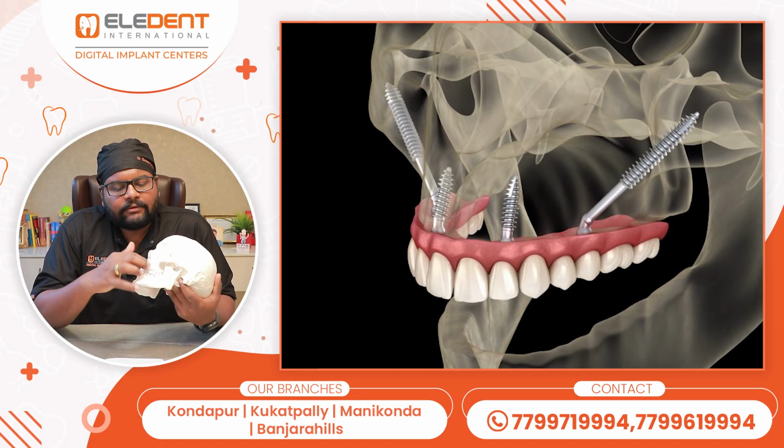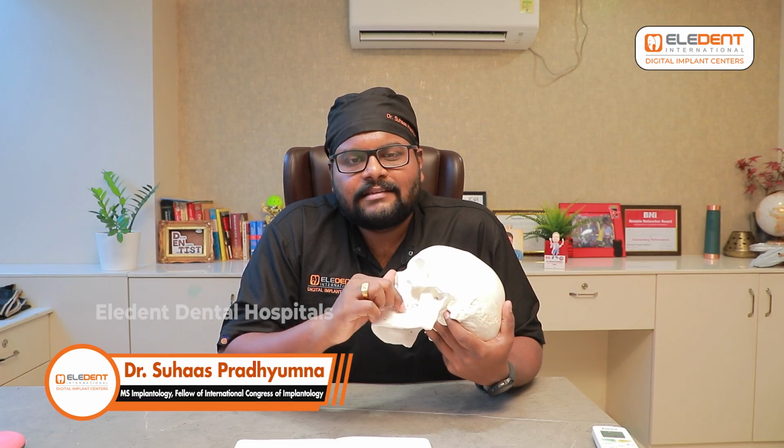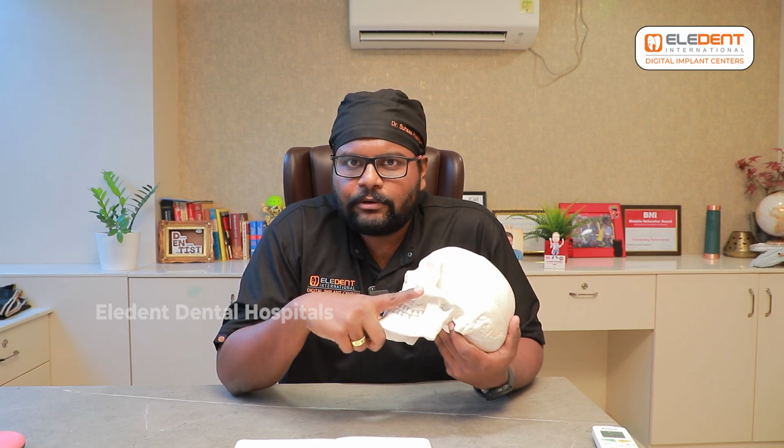Third is zygomatic implant. We don't place an implant in this region. We use the cheekbone, the zygomatic bone, and place a long implant. That is the zygomatic implant.